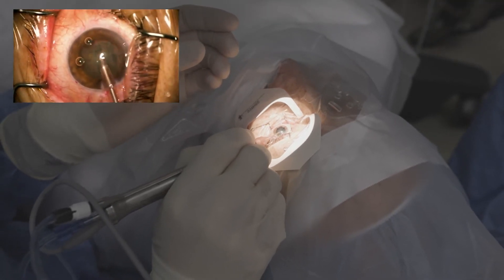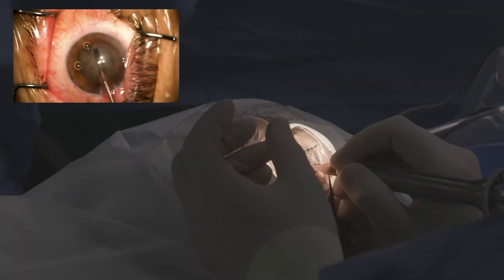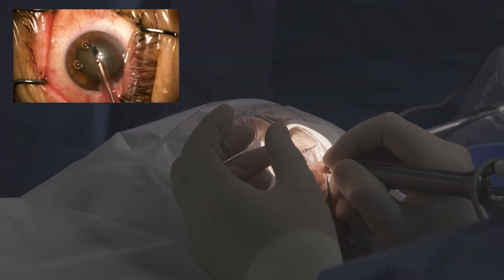With overlap, there's a little more chance, because this is a three-piece lens, that that lens will bulge forward a little bit — just vaults a little more anteriorly — and that can just make your end of the procedure a little more of a struggle.